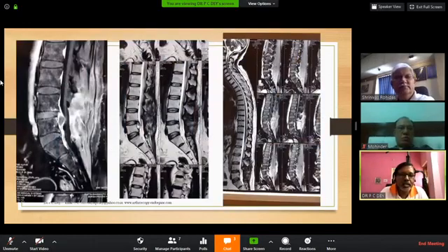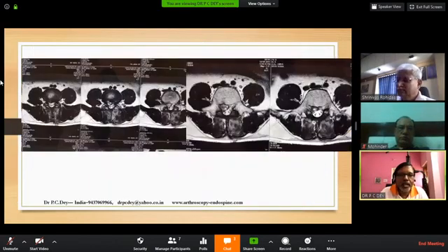And this is the contrast MRI I did, and I found a recurrence of the disc at the same level, L4-L5, extruded, and also a little bit migrated downward, not like the previous one. The previous one before surgery was huge, extending almost 1 level below, but this is a small one in comparison. So this is after surgery. This contrast MRI also shows the same level, the same site, on the right side.